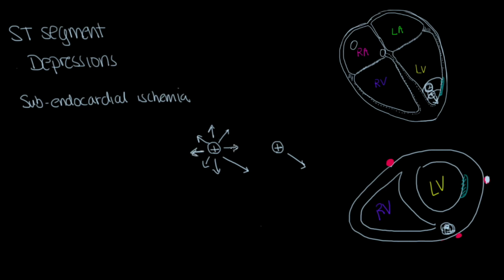The charge is propagating that way, cancels with that one. This one cancels with this one. This one cancels with that one. This one almost cancels with this bigger one, but there's a little bit left here, and that's what we see over here when the ECG picks up the overall signal going that way.